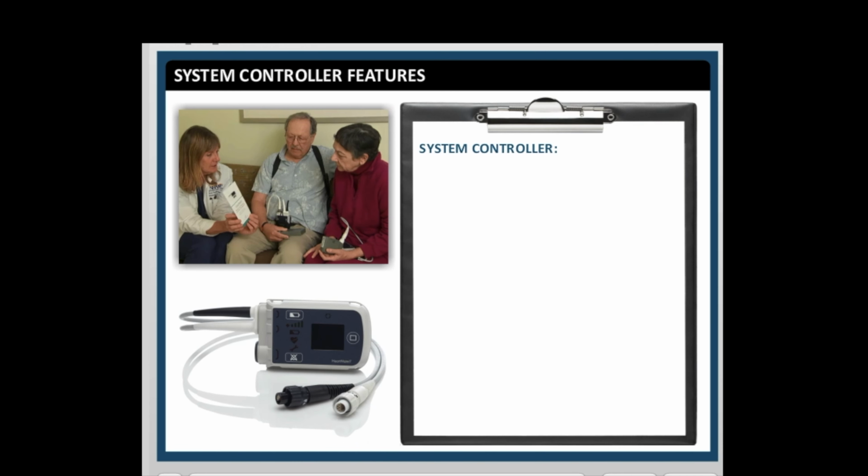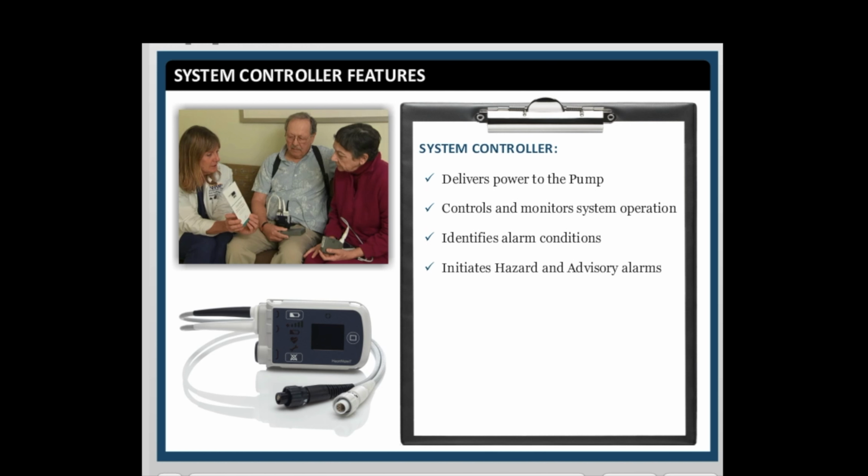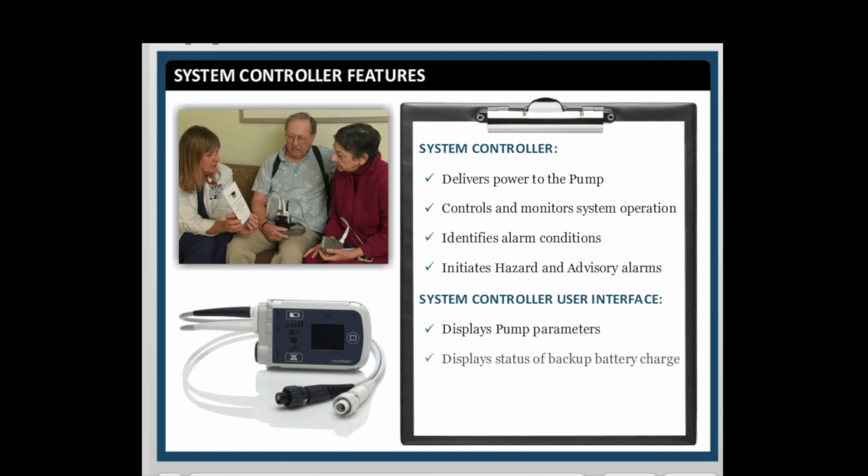The system controller delivers power to the pump, controls and monitors system operation, identifies alarm conditions, and initiates hazard and advisory alarms. The user interface displays the following: pump parameters, charge status of the backup battery, visual alarms with clear, actionable instructions, and an accessible alarm history of the last 6 most recent alarms. The system controller can be programmed to display information in various languages.